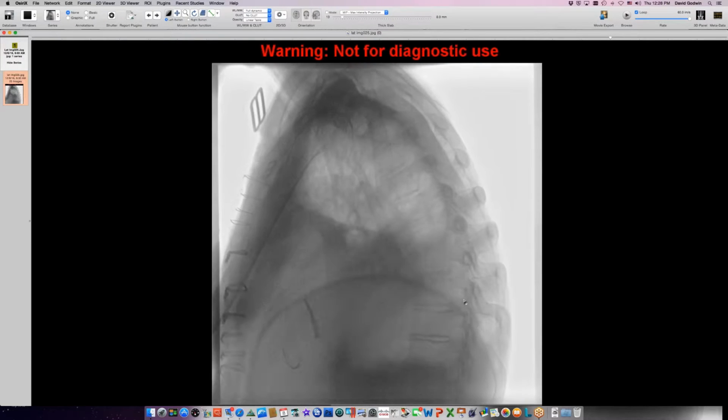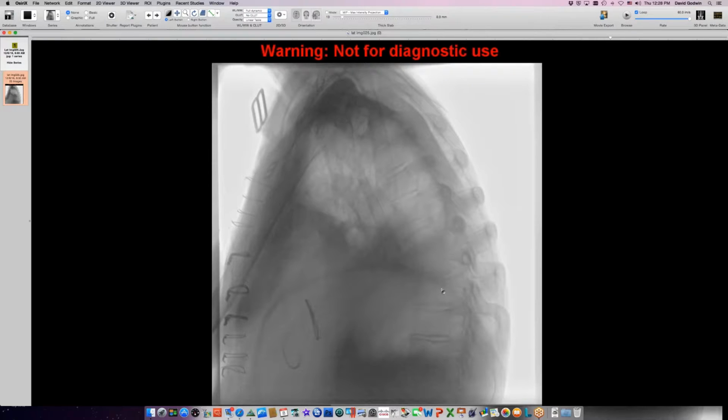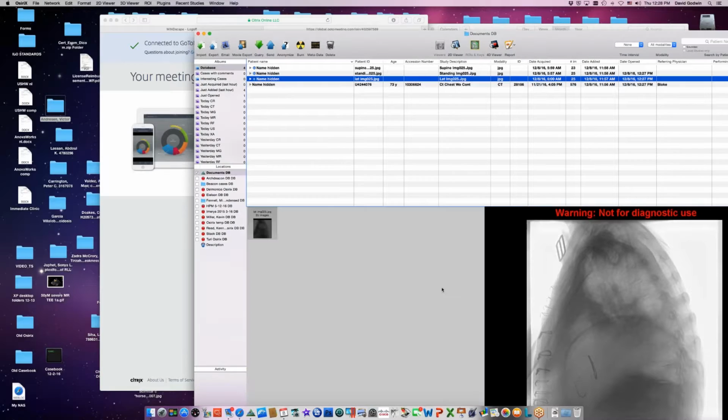So once again, the lateral view is very helpful in this fluoro because the most vigorous motion is posteriorly, which is going into the crus. If you want to pull the diaphragm down, the fibers that are directed in the best direction to get the most mechanical effect pulling down are the fibers of the crus. That's really where most of the diaphragm motion comes from, and it's really just anchored elsewhere, but it's moving largely through the function of the crus. So indeed, seeing some normal muscle looking anteriorly on the CT scan, and around the aorta where the crus muscle is, helped us predict that his diaphragm motion would be normal on fluoroscopy.